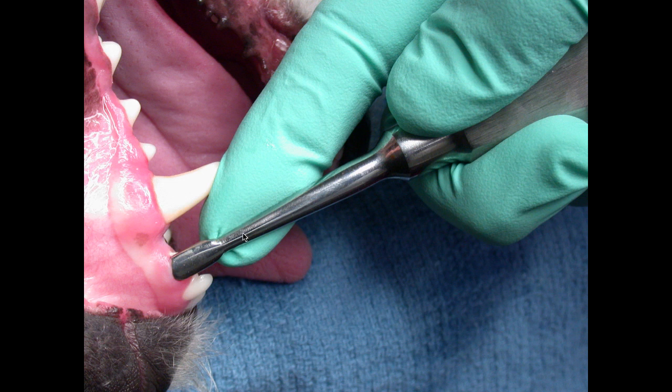When we place this instrument into the space between the bone and the tooth, we want to use a wiggle motion to gain purchase between the tooth and the bone. But once we're there, we don't want to wiggle that luxator elevator back and forth. We want to torque it and hold it with firm, often progressive pressure as we feel that tooth give away a little bit against the bone, and not start on another area until that 15 seconds has been satisfied.